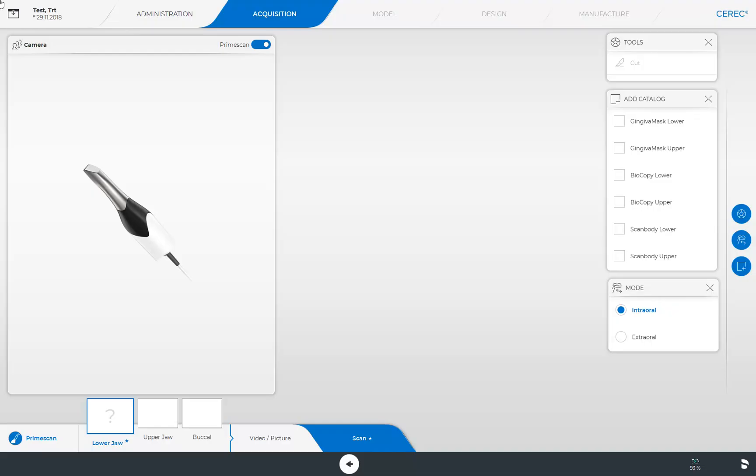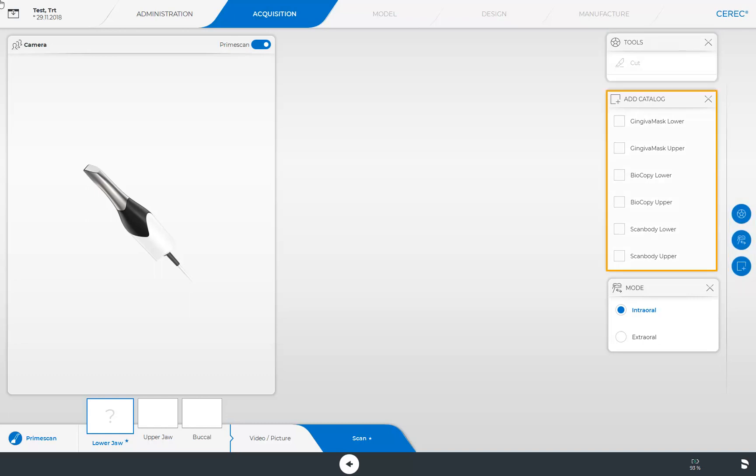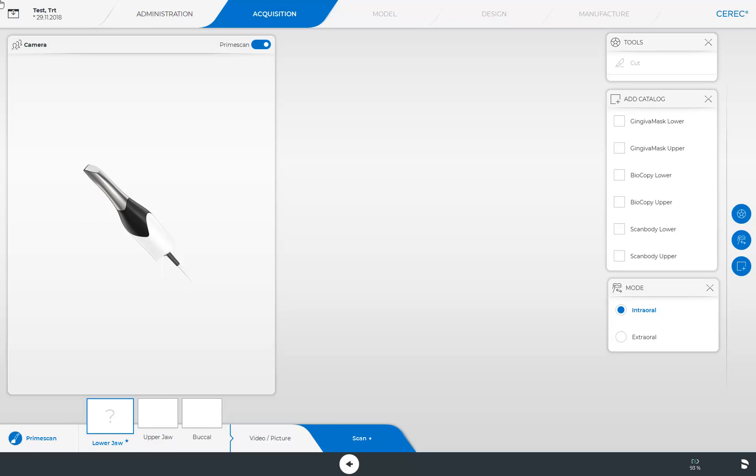We are already in the Acquisition Phase and have turned on all three options in the Page Palette: Tools, the Add Catalog function, and the Mode option. In this phase, only the Cut function is available in the Tool Palette. Since we haven't performed any scan yet, the tool is displayed as Disabled.